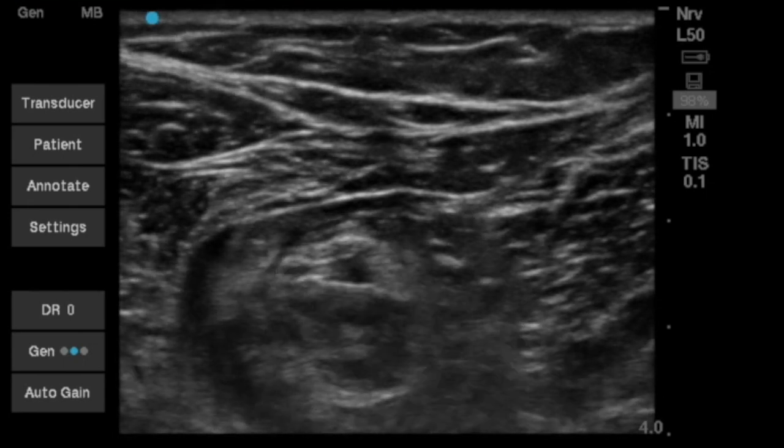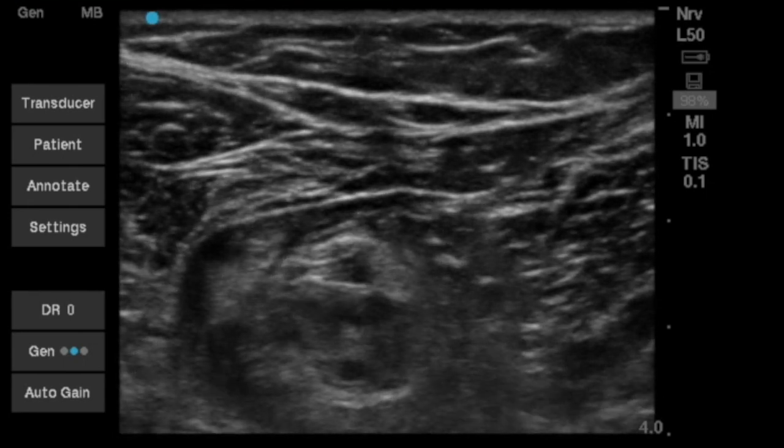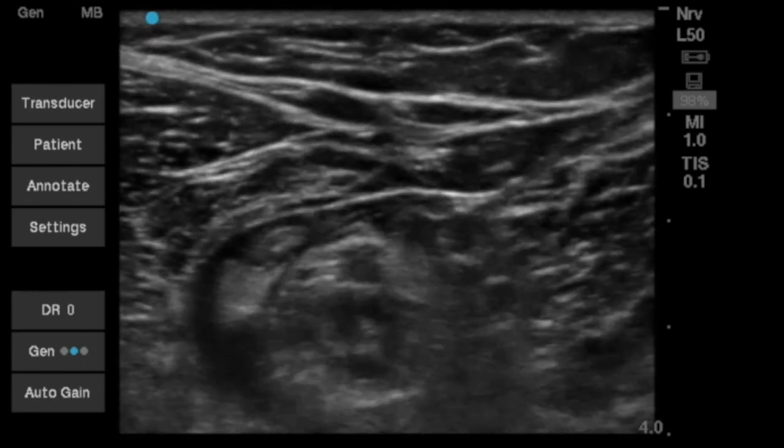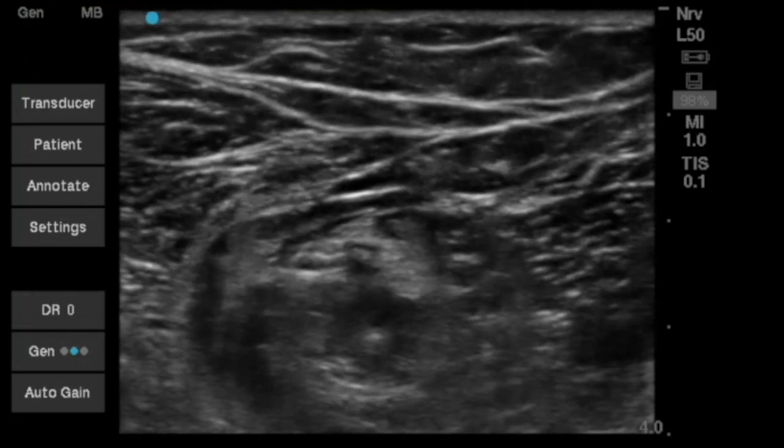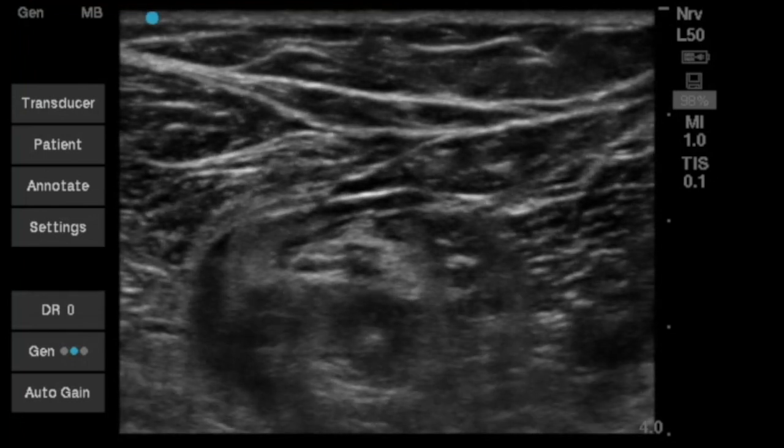Here, more local anesthetic is added to the tibial division.